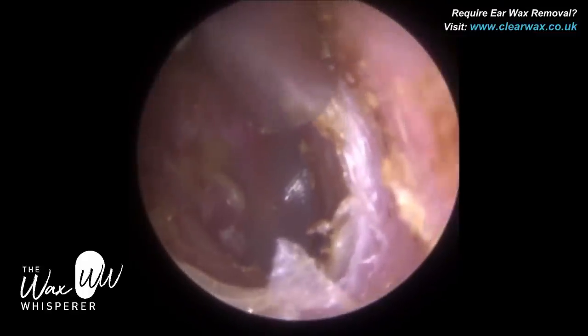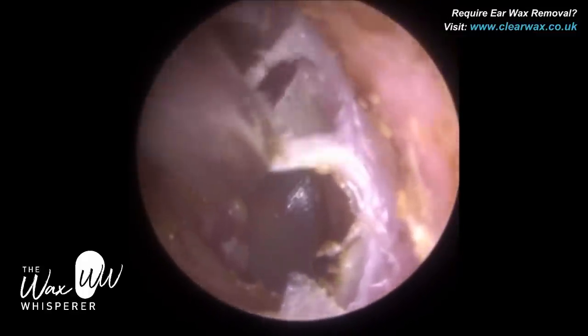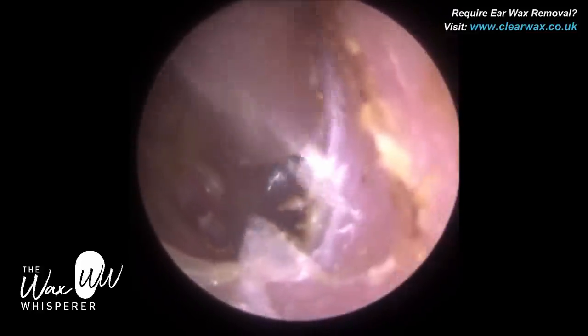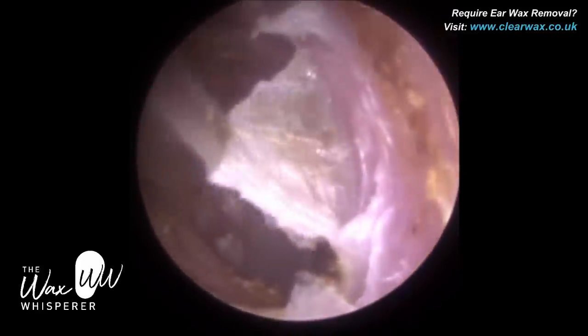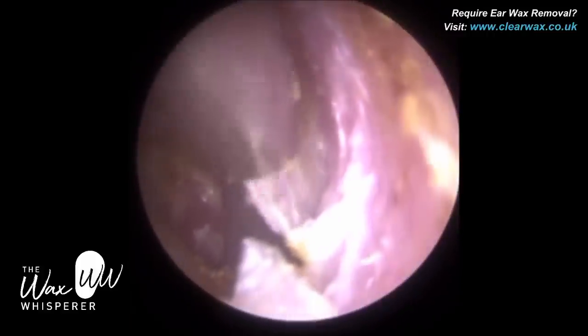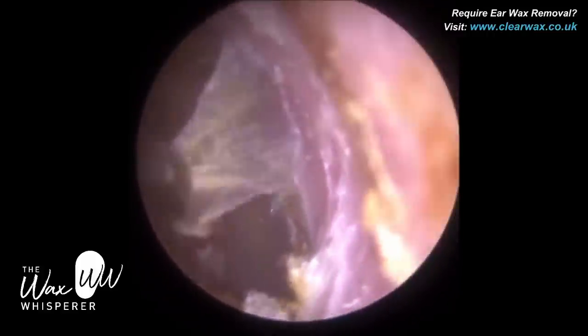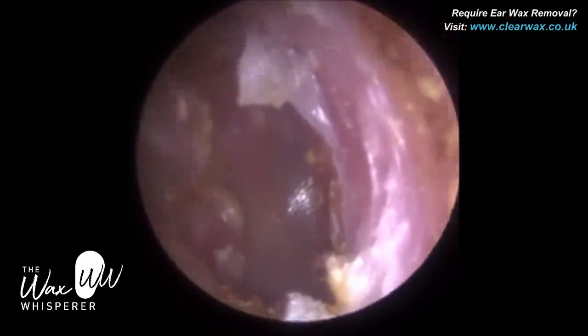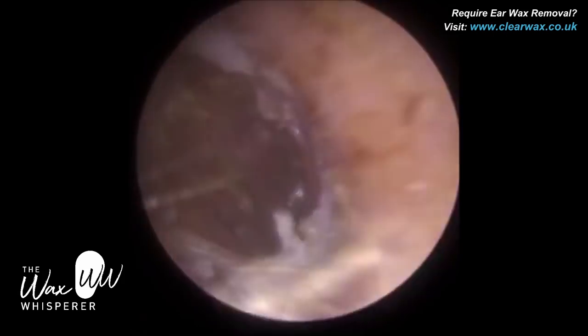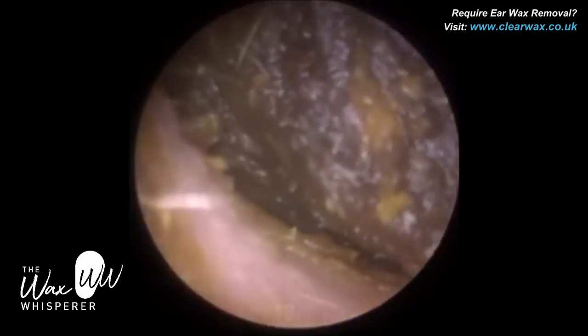So I've cleared this main blockage. What I'm doing now is addressing a layer of dead skin — it is dead, it's just not migrated. I'm trying to remove as much as possible, but I believe this patient developed a caloric effect, so I had to stop. Symptoms are completely alleviated now. The ear is fully visible and healthy, but there is a lot of dry skin.